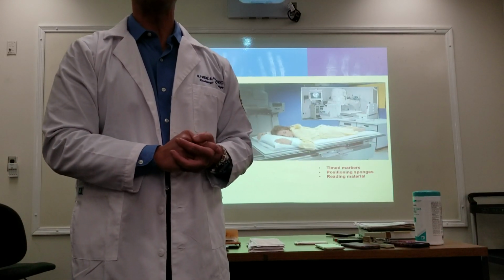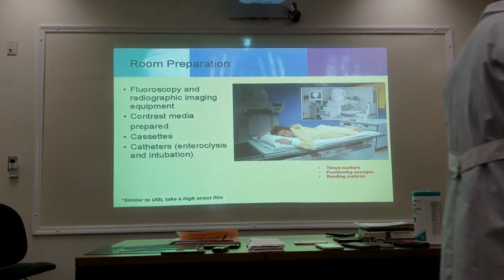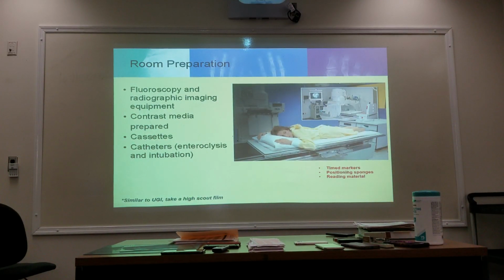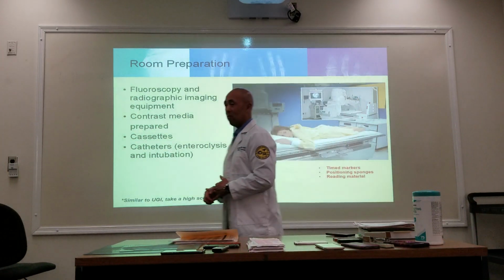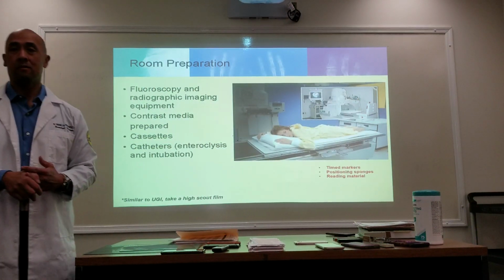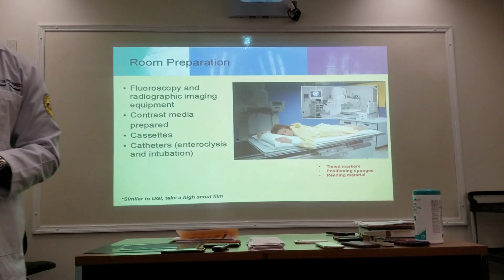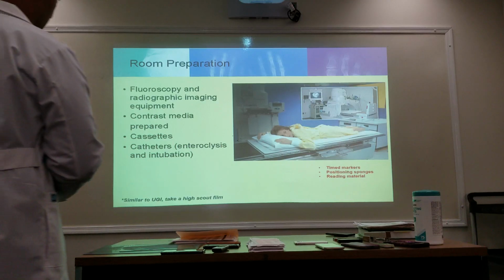So we want to see it prior to the patient ingesting the contrast. Again, once the contrast is there, it'll hide it. Okay, so that's what the scout film is for.